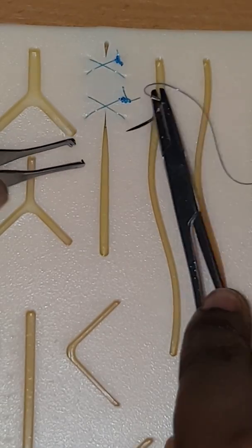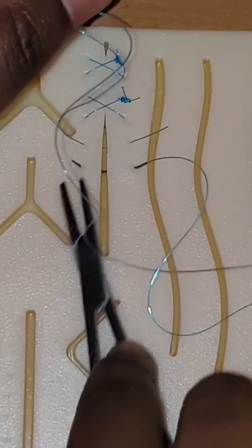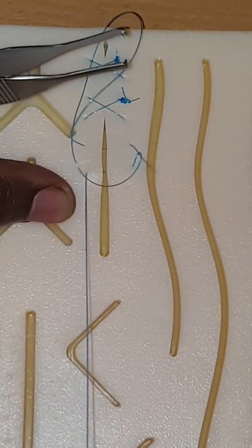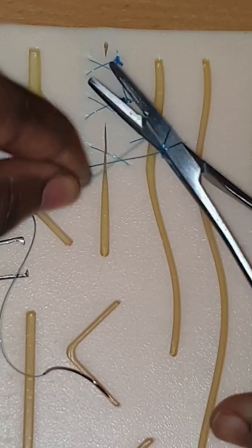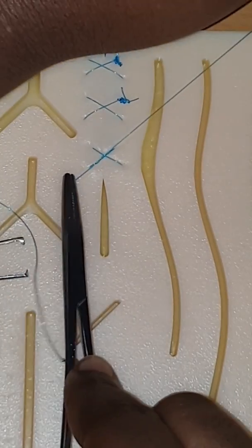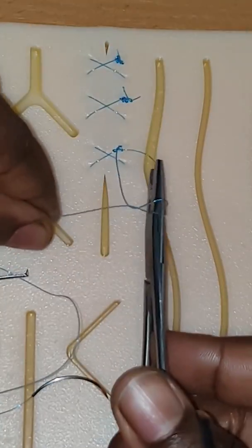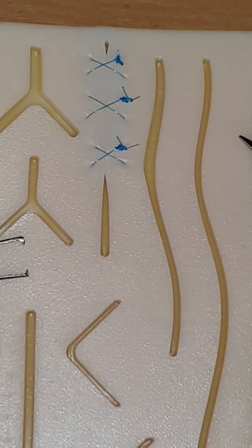Make sure when you pull in the third, pull it out of the loop and then inside the loop. Now we're going to tie it off: one, two — once, and again. For these last two I'm just going to speed up the video.